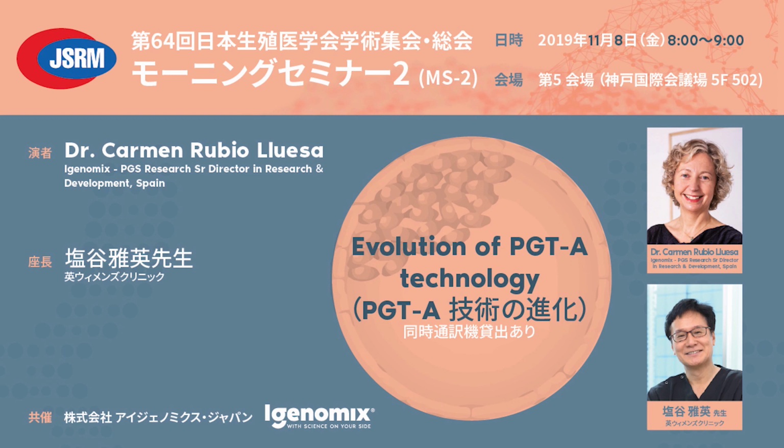Okay, so the concordance rate of NIPGT and trophectoderm biopsy is almost 100% when the embryo has only one chromosome aneuploidy, you said. And still, you said we can transfer the red criteria embryos, 1 or 2 chromosome aneuploidy embryos. But when we transfer the 1 chromosome aneuploid embryos, if the concordance rate is 100%, it means that we transferred aneuploid embryos. Is it okay?